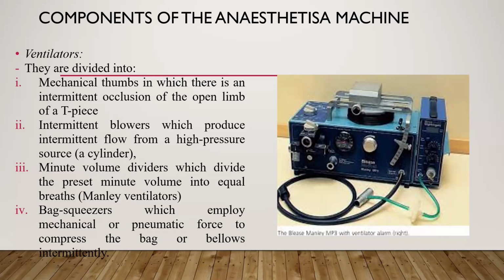Then we have the bag squeezers, the bag and bottle ventilators, which could use mechanical or pneumatic force to compress the bag or bellows intermittently. So most anesthetic machines have ventilators.